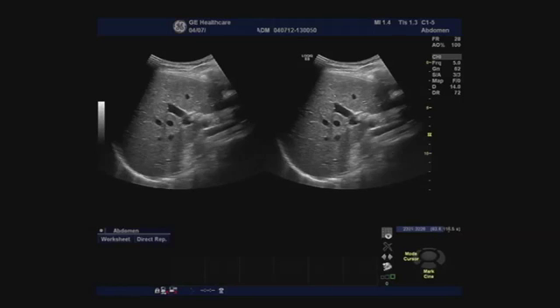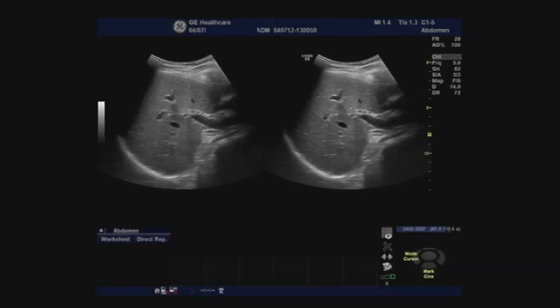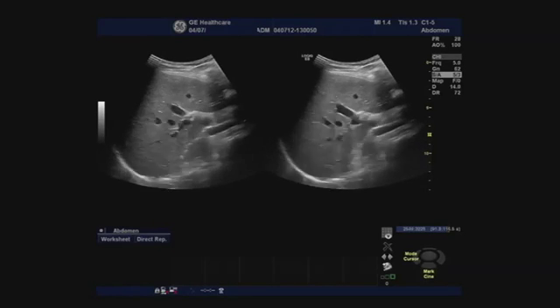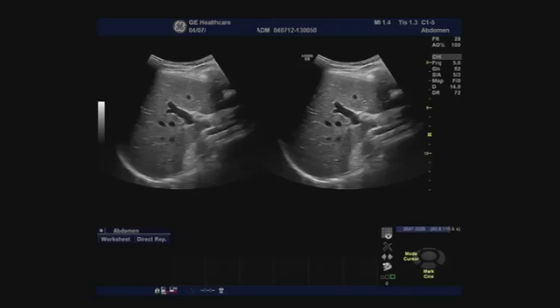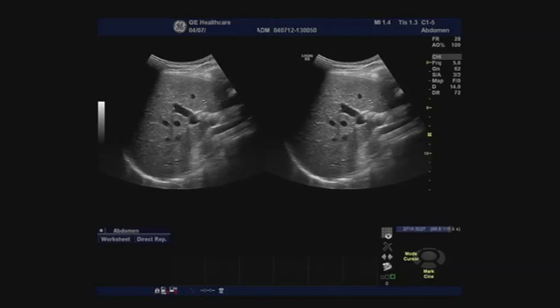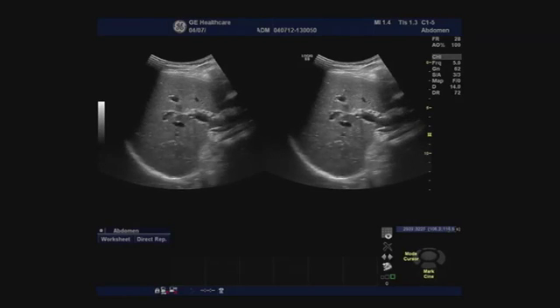It gives you confidence as a user to understand what SRI is doing to your image, but also you can change the levels to see how much you're benefiting from this. So the important thing is you really need to understand what it's doing for you and what you're gaining from it. You're not going to lose anything, but there is a learning curve with SRI, especially if you're not used to it.